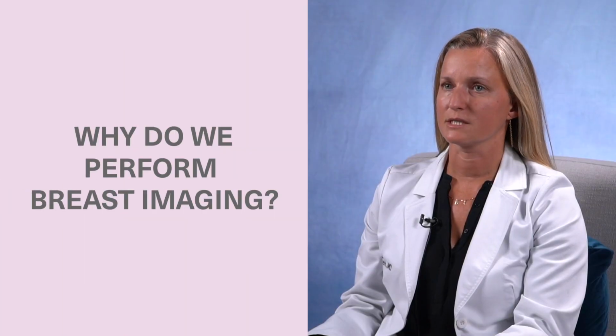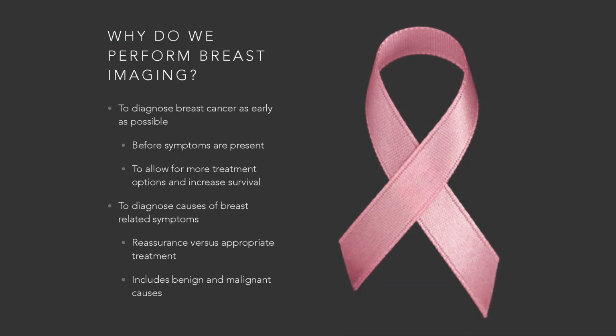Why do we perform breast imaging? We want to find breast cancers as early as possible, before symptoms are present, which can increase survival, but also we're increasing treatment options for those breast cancer patients.